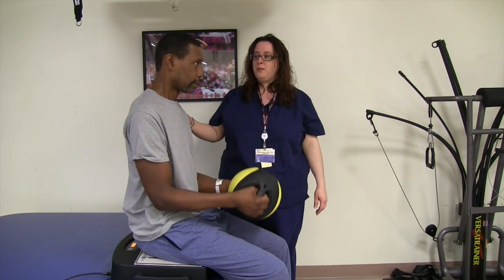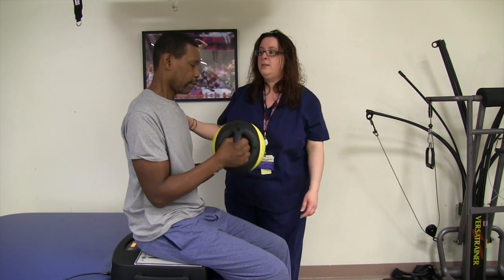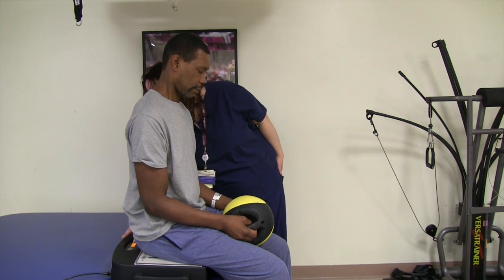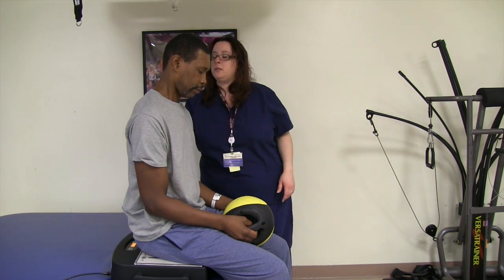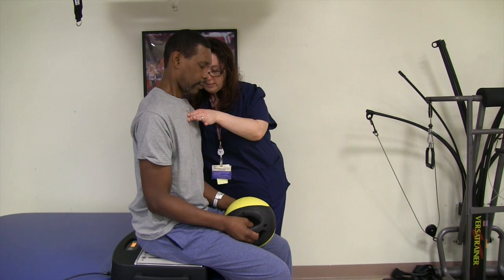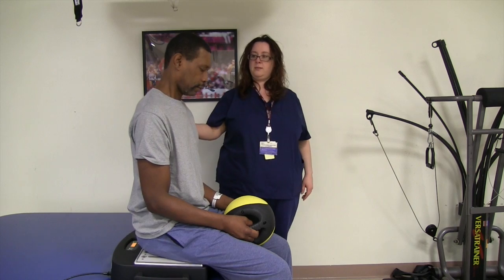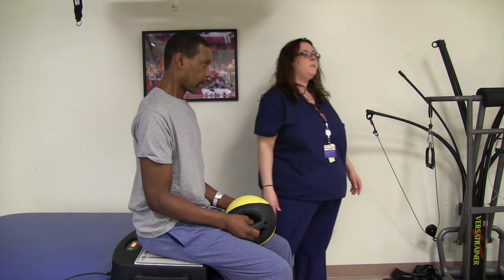All right, you ready? This is while vibrating. Okay, you ready? All right, so now we're going to start again, except while vibrating — you're going to sit nice and tall. Good, okay, nice and tall. Get your bearings.